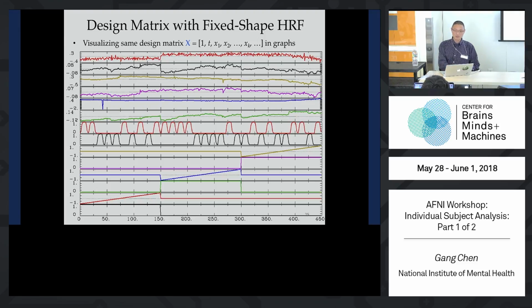For example, during pre-processing, we do slice timing correction. That's basically we artificially align those multiple slices, right? When we acquire the data from the scanner, each slice is acquired separately. We don't take a snapshot of the whole brain. That's not the way the scanner works. So one slice, second slice. I mean, there are different orders, but anyway. So we need to manually align them, put it at the beginning of the TR. So that is just for easily for us to build up the model, right? So that's a pre-processing step. Smoothing, same thing.